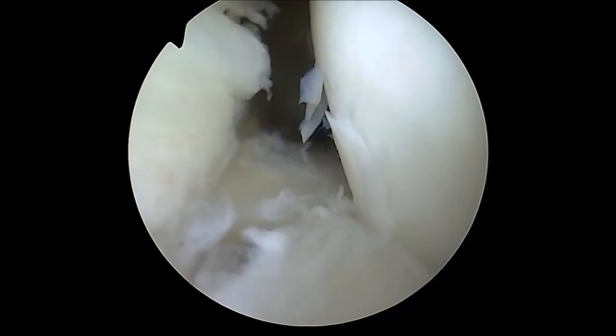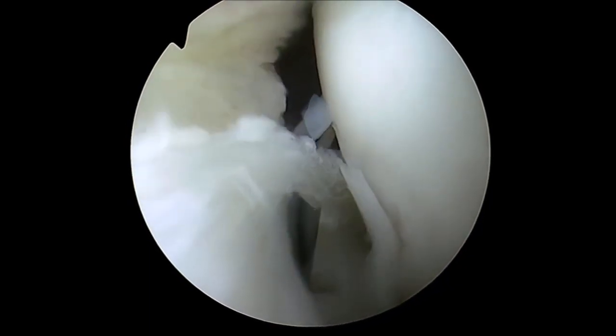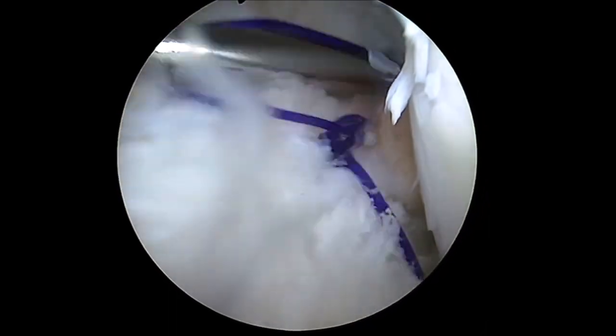Next, with a rotational movement of the hand, the hook passes through the inner portion of the meniscus, releasing the PDS, which is grasped and brought out through the portal.